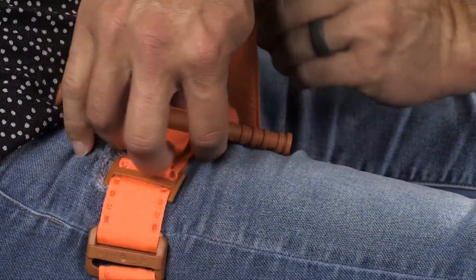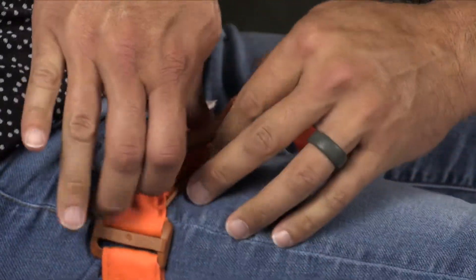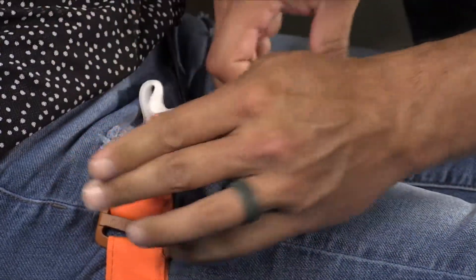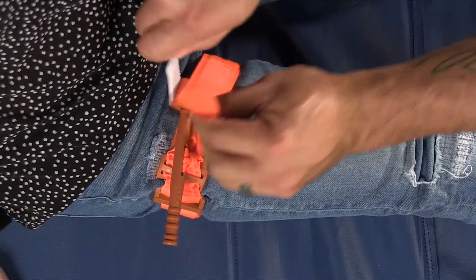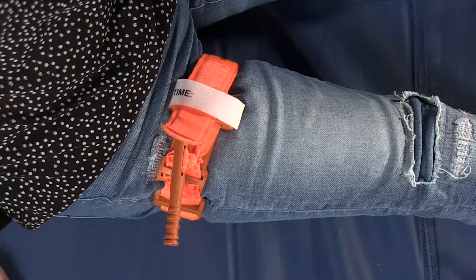Bring the band to the windlass clip but not through it. Turn the windlass until bleeding stops and secure it in the clip. If you have any band left, pull it through the clip and place the securing strap over it. Write the time on the tourniquet if possible.